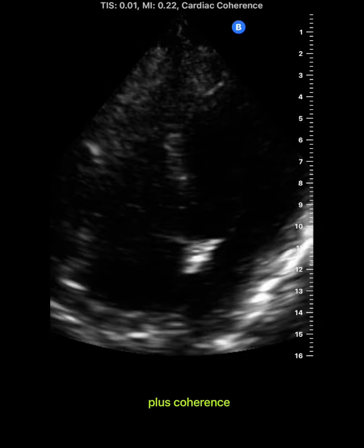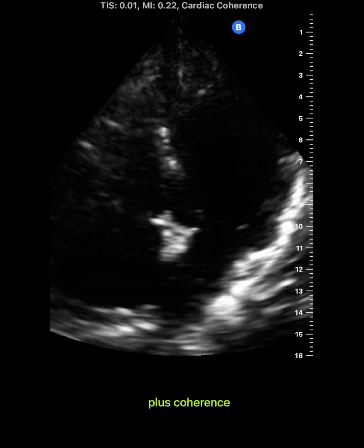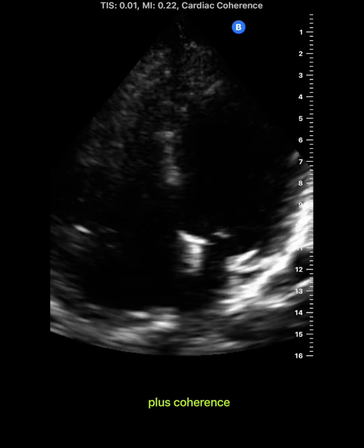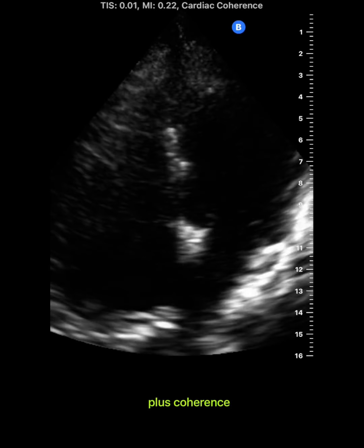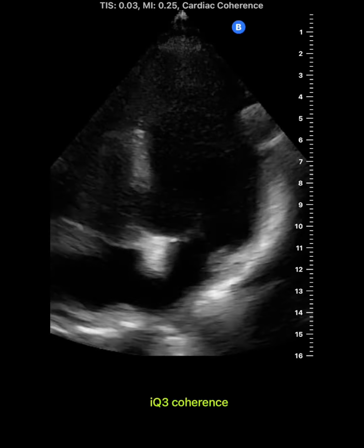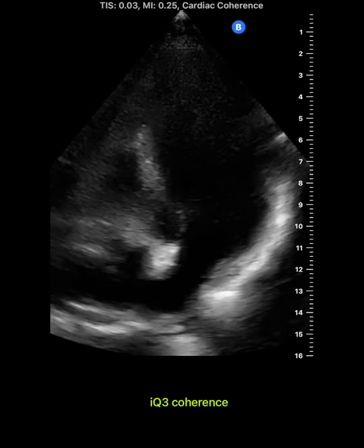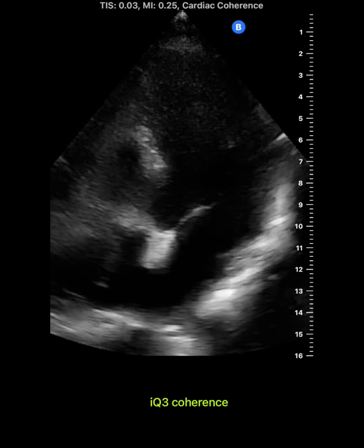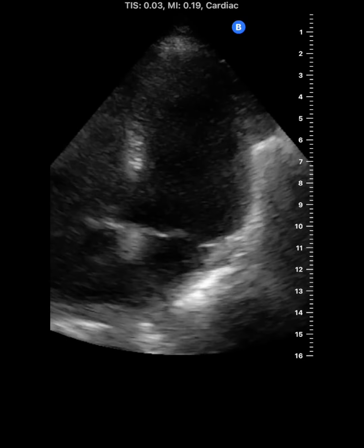You might recall that the old IQ Plus also had a cardiac coherence mode — an ultra-high contrast view designed to help see wall motion, but frankly it was really grainy, and I didn't find it all that helpful. The IQ3's coherence mode is a huge step forward. Instead of grainy, it's really smooth. All of that noise is gone, and you can really clearly see the wall motion now.